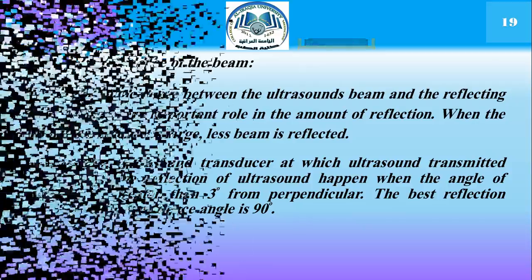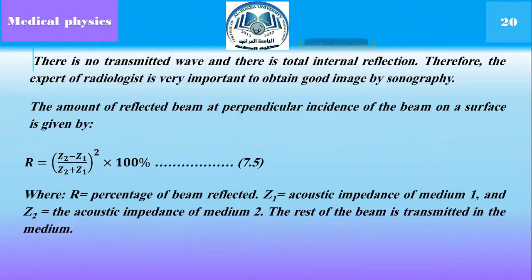There are no transmitted waves and there is total internal reflection. Therefore, the expertise of the radiologist is very important for a good image by sonography.